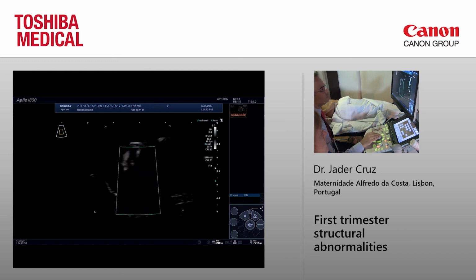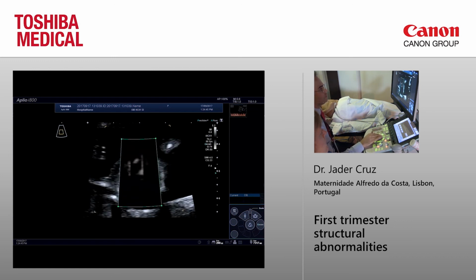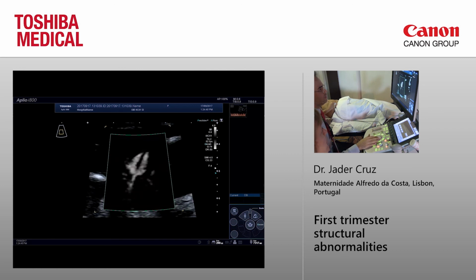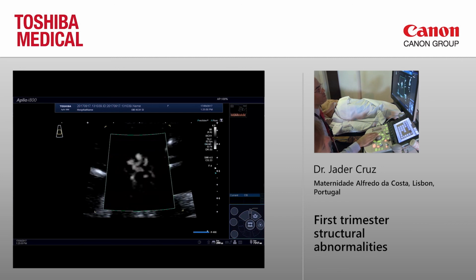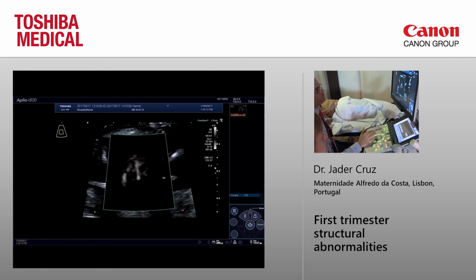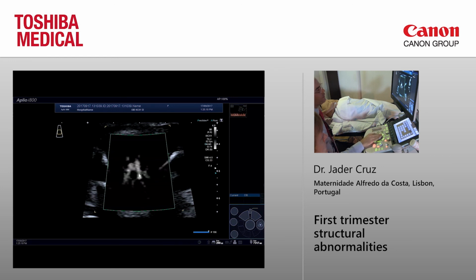Okay, now I'm just going to move on to ADF because the baby now is behaving. So you see that very clear. Yeah, you see the aorta. You can see that, yes? Then you see pulmonary artery with the branching. And actually you see something very nice because you see all the branchings of the pulmonary artery when you have a nice view. That's not really clear here, but you can see the left and the right branching and the duct. So it's really nice there. And that's what I'm talking about. You can see the 3 vessels in the 3 vessel view.